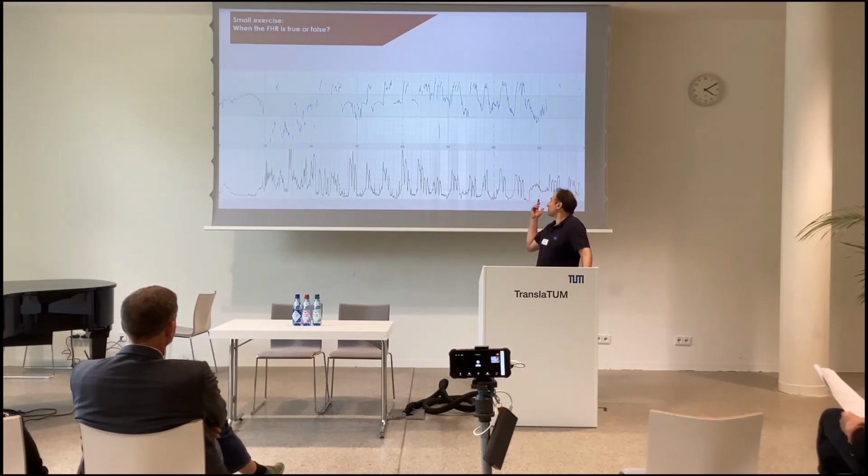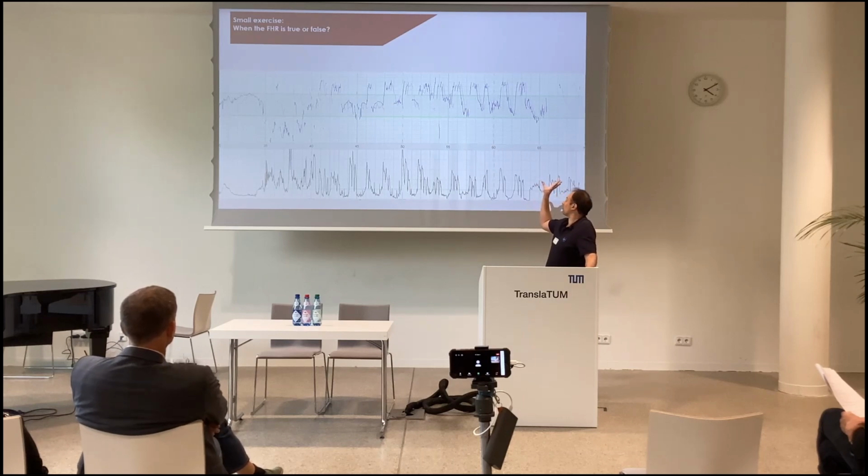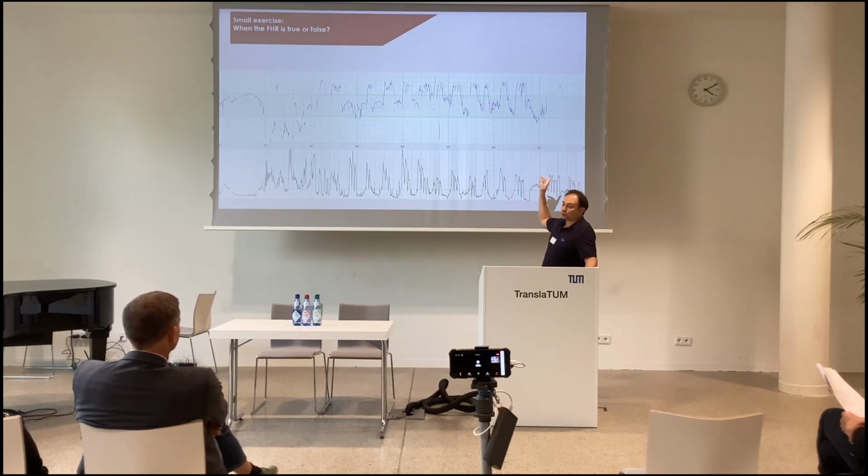Without the maternal heart rate, it's kind of complicated, but fortunately, for some years now there is the maternal heart rate which is recorded with other sensors, and we can see if they match. But as you can see, there is a 12-second delay, particularly on Philips monitors, but I guess it's for every CTG monitor.